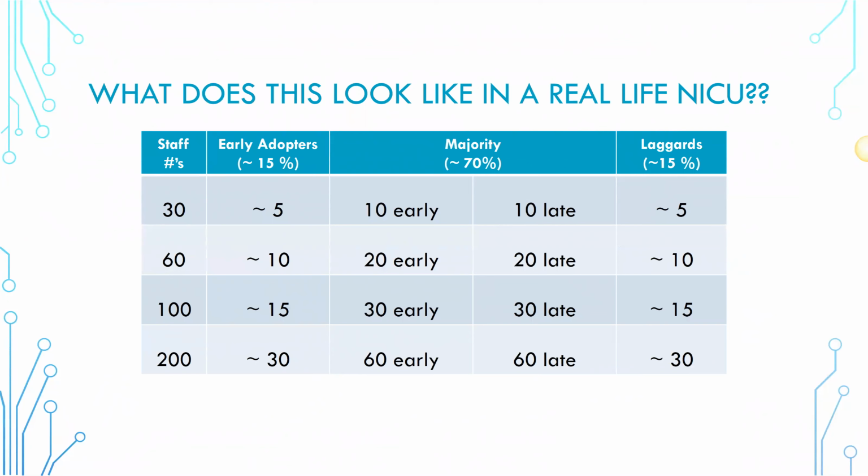So some of these patients, like seizures, we do aEEG, but we always get continuous video EEG as well. So that just means that we may start aEEG if our tech is a couple hours out, and then we'll continue with that, with the continuous EEG once we can get it. And then once we do, we are able to hold our aEEG algorithm on top of our video EEG. So this is just something that we came up with. It's worked in other hospitals as well. So I think you can look at your population and then you can kind of decide. We actually tracked our population for about a month before we made our recommendations.